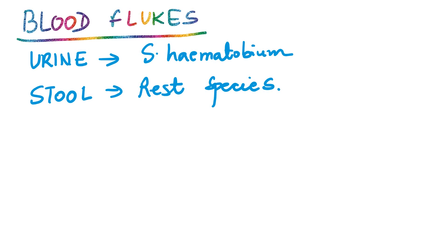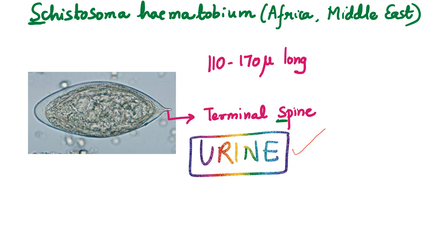One species, Schistosoma haematobium, has adult worms in the vesical plexus, so the eggs are demonstrable in the urine. Schistosoma haematobium is primarily reported from Africa and the Middle East. In exam questions, there will typically be a mention that the patient has traveled to Africa or the Middle East. In the urine you see non-operculated, elongated, ellipsoidal eggs, 110 to 170 microns long, with a terminal spine — this is Schistosoma haematobium.